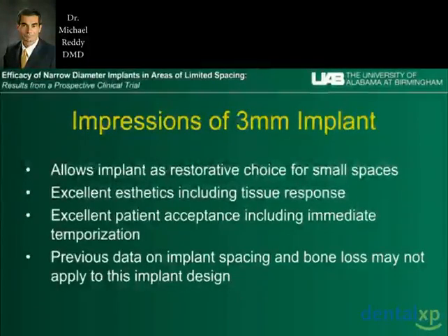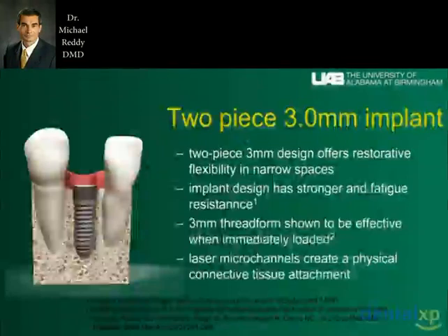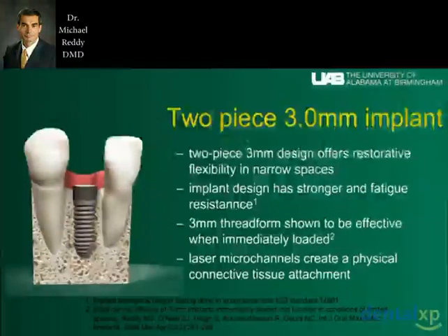There's an excellent tissue response. Patient acceptance is very good because they love the fact that you put the implant in and immediately temporize it. And the data certainly seems to lend toward that. Now, the exciting news is the creation of a two-piece 3.0 implant. And the importance of this is it offers restorative flexibility in narrow spaces. So whereas the one-piece implant was one piece and all you could do was prepare it, now you have an implant that has some improvements over it.